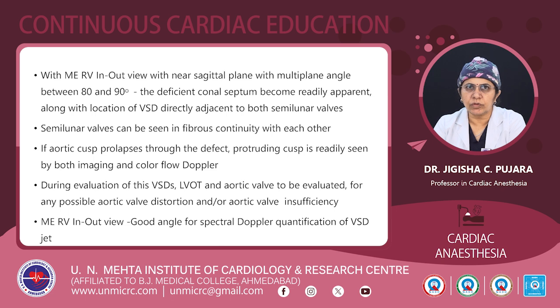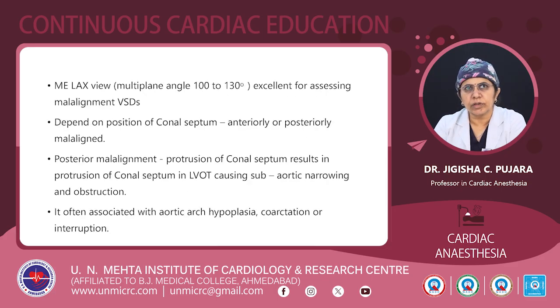The mid-esophageal RV inflow-outflow view is a good angle for spectral Doppler quantification of the VSD jet by continuous wave Doppler. The mid-esophageal long axis view, multiplane angle 100 to 130 degrees, is excellent for assessing malalignment of the VSDs, depending on the position of the conal septum, anteriorly or posteriorly malaligned. Posterior malalignment results in protrusion of the conal septum into the LVOT, causing subaortic narrowing and obstruction. It is often associated with aortic arch hypoplasia, coarctation of the aorta, or interruption of the aortic arch.